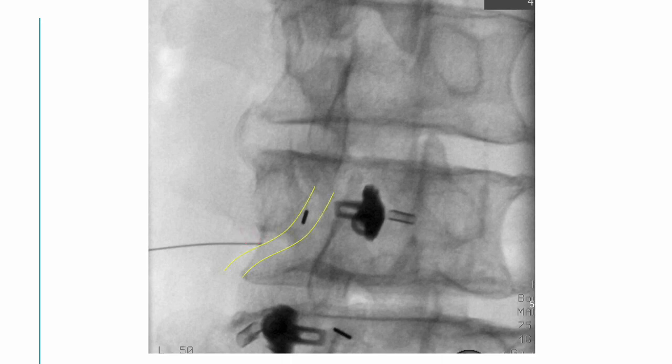I must draw an imaginary line over the nerve roots and move the needle slowly while communicating with the patient, under control lateral oblique image guidance.